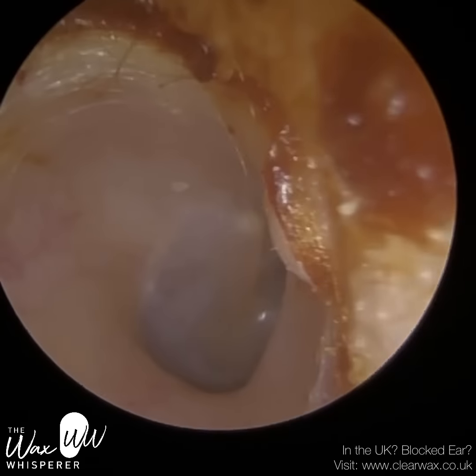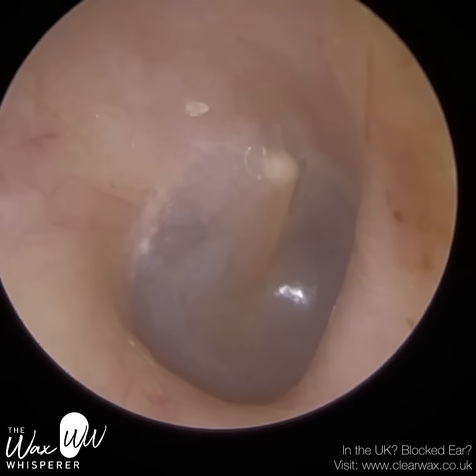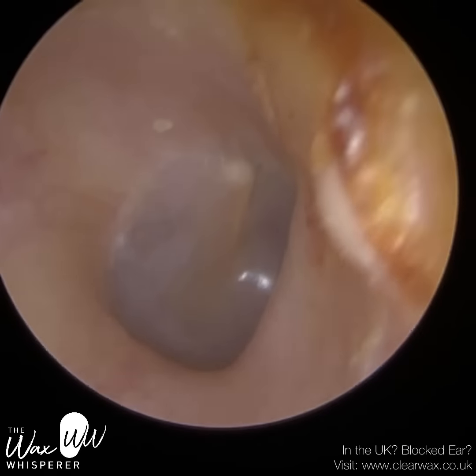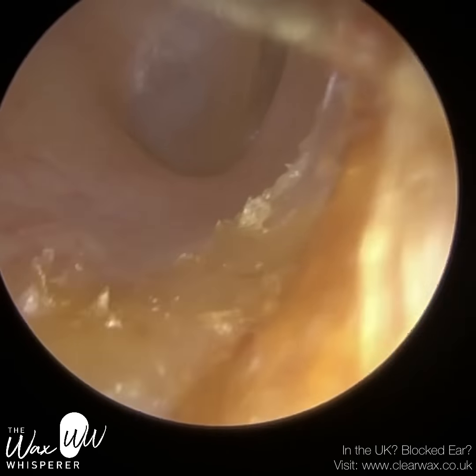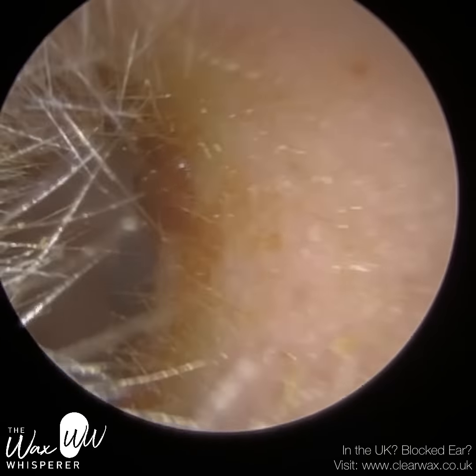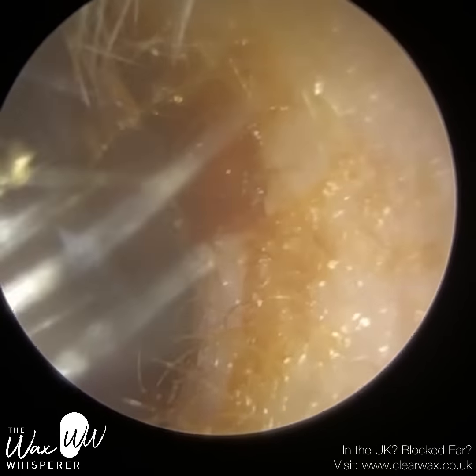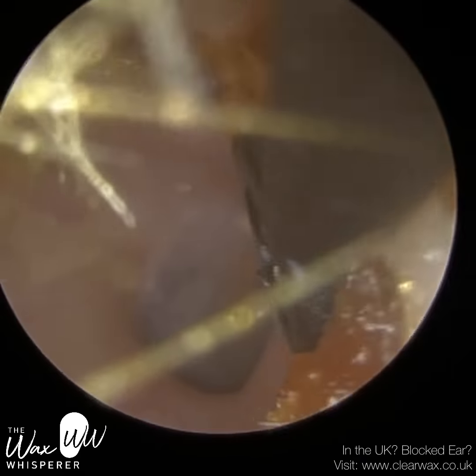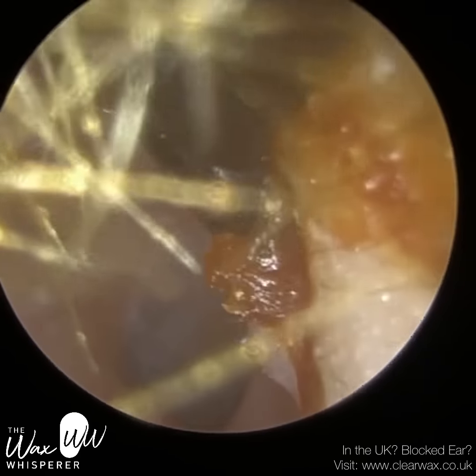So I managed to remove that wax plug. Lovely, healthy eardrum — we've got a fantastic view there. I've got a little pimple to the right-hand side of the ear canal just there. The ear is clean, but because all this wax is in the cartilaginous portion, I just went back in with a Jobson Horne and I'm just gently applying some pressure on the cartilaginous portion.